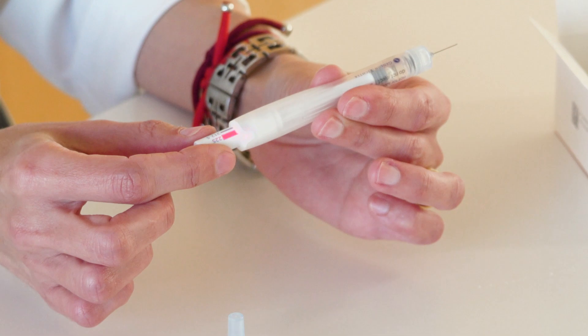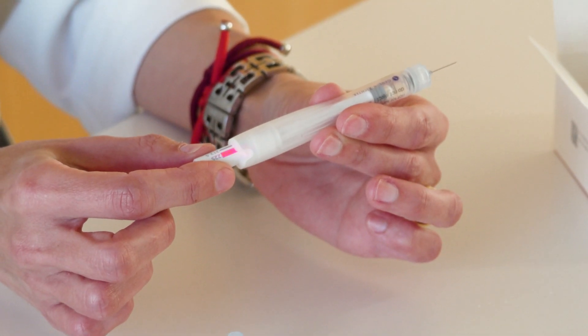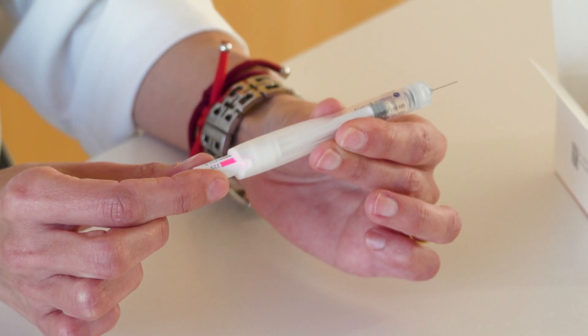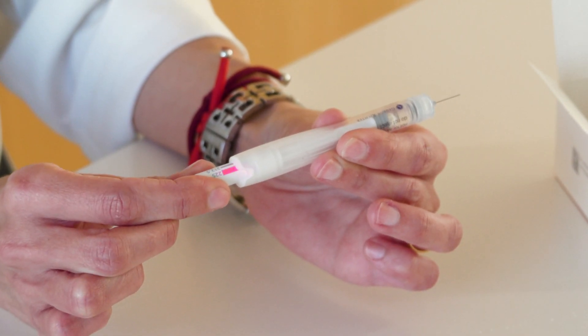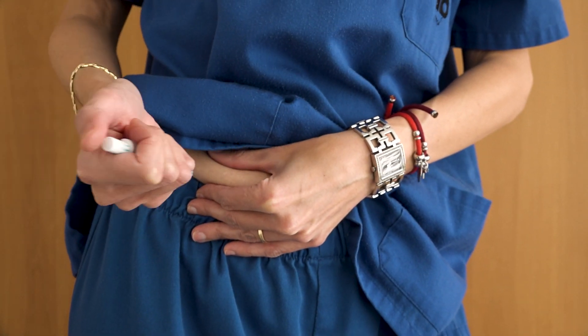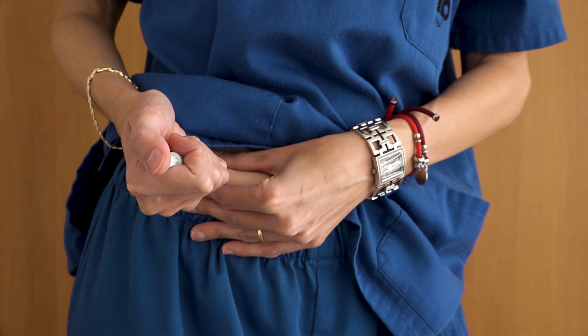Next, select the recommended dose on the upper part of the device and proceed to inject it subcutaneously into the abdomen area. For the injection, disinfect the area with alcohol, pinch the abdomen forming a fold, and inject the medication by pressing the upper part of the pen.